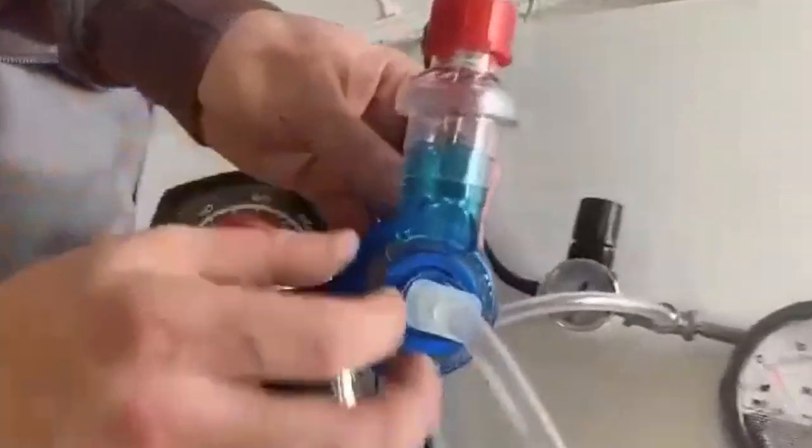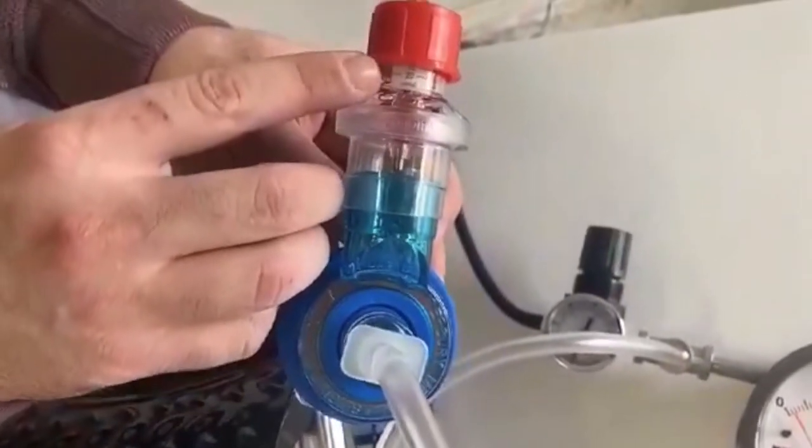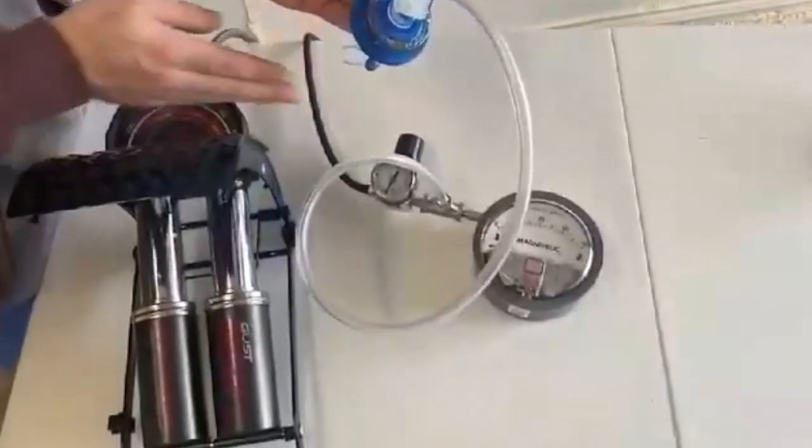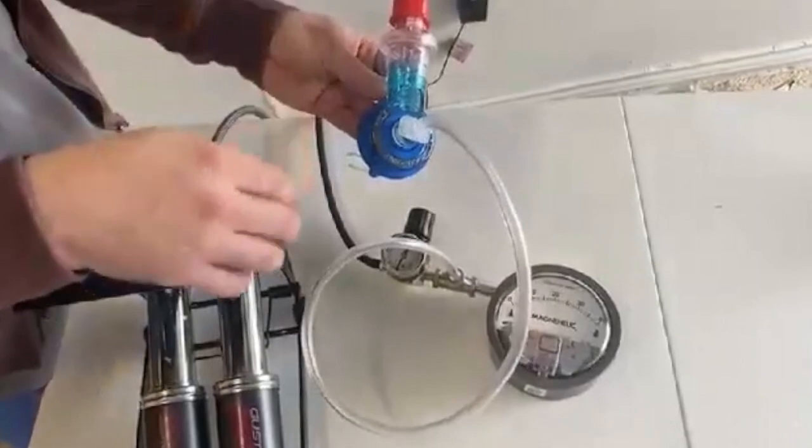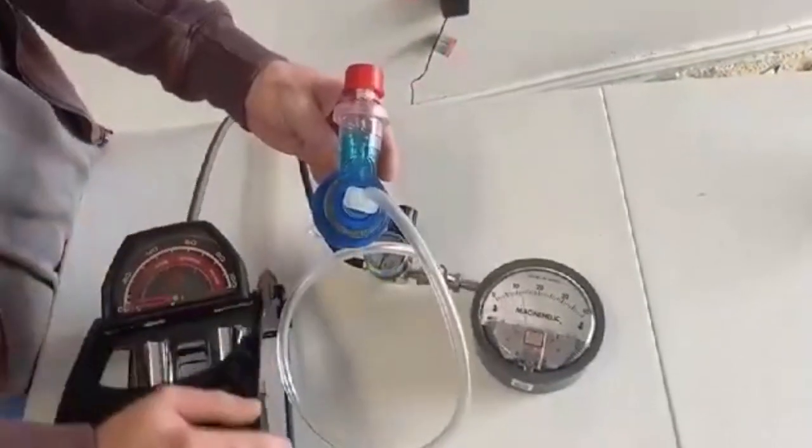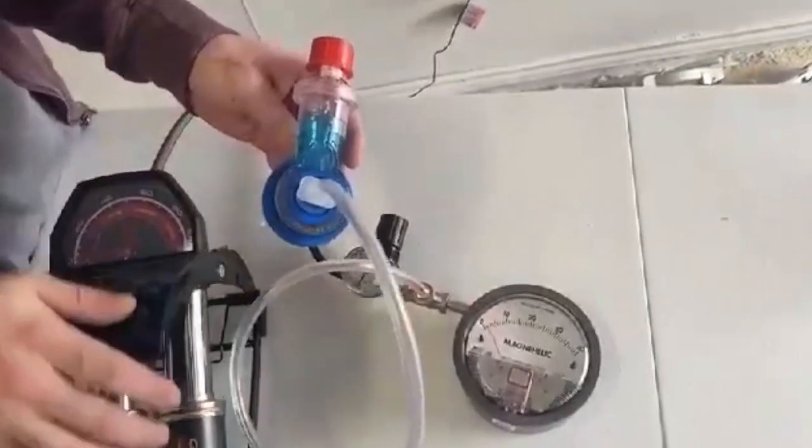Now I attach to the system a regular PEEP valve and set it to 15 centimeters of water so that when the pressure goes through the system at 15 centimeters water it will escape. So if we take a look at the scale, it should only go till 15.